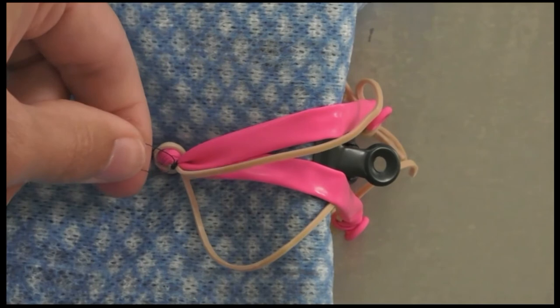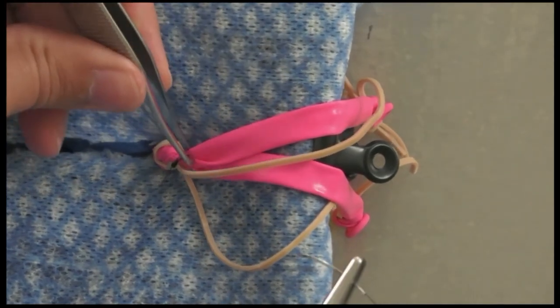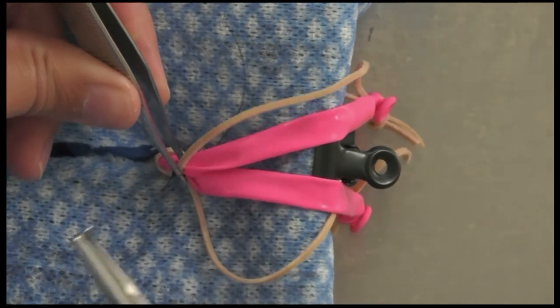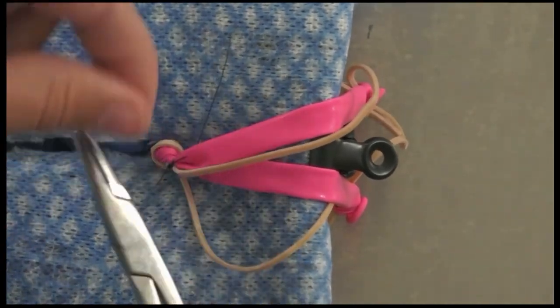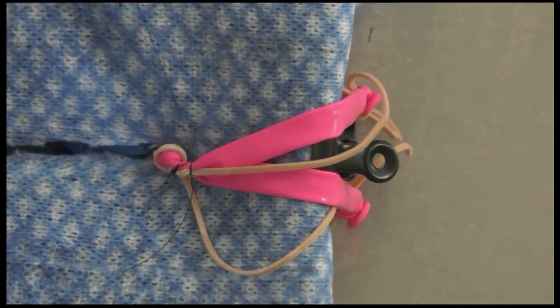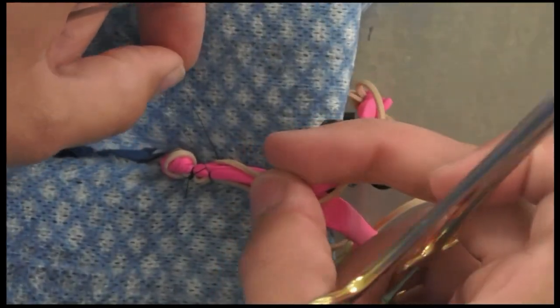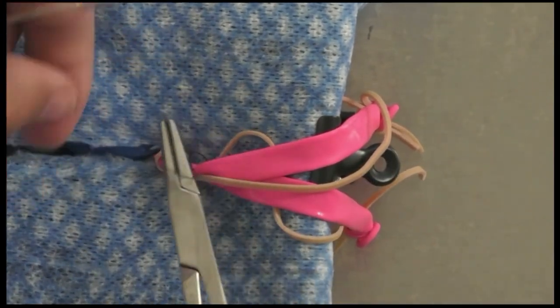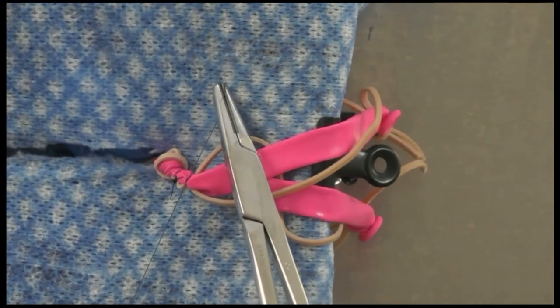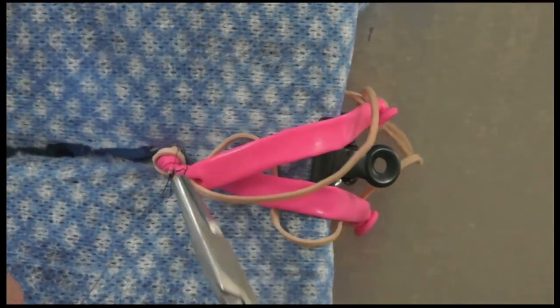I usually don't apply a hemostat until after my ligations, or apply it far enough away that it doesn't interfere. Here I'm doing a transfixation ligature. I like to put a surgeon's throw on one side — you could also do a second throw, but a surgeon's throw is totally acceptable — then wrap everything around and do a normal four-throw square knot on the other side, making sure to really strangulate all that tissue down. The uterus can be very friable.